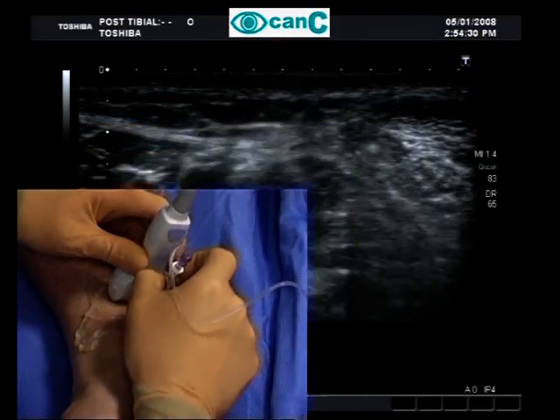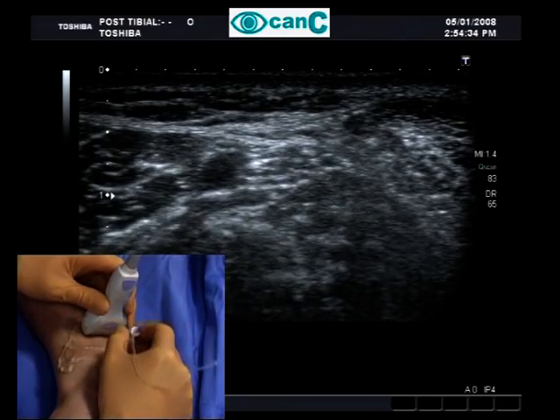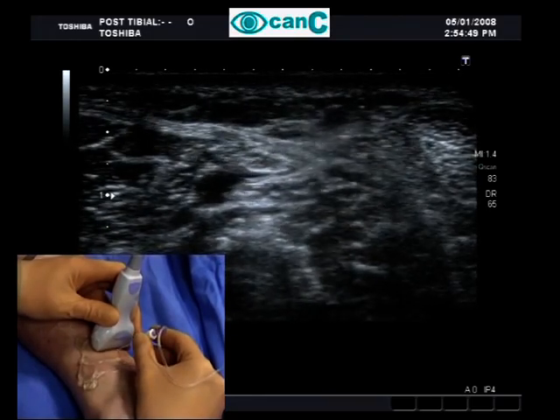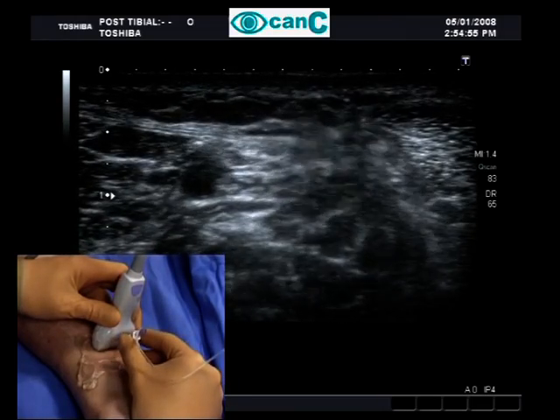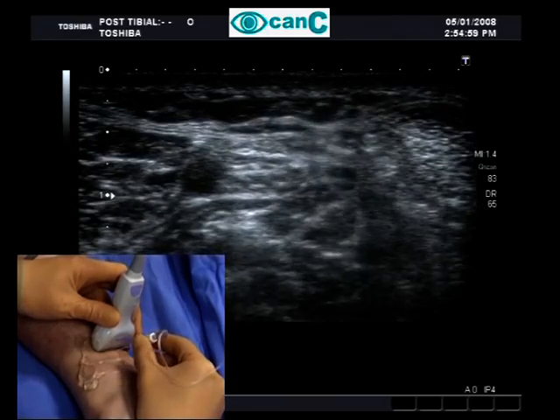Using the out-of-plane technique, the needle is inserted at the midpoint of the probe. Once through the skin, adjustments to probe angle and needle direction are made to identify the needle tip. Small, bouncing movements of the needle are used to help locate the needle tip.